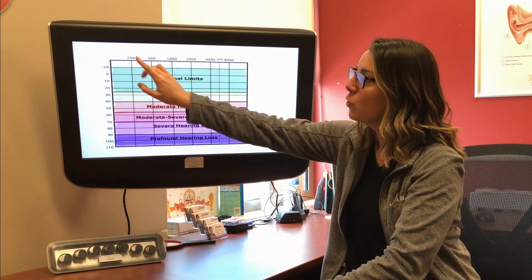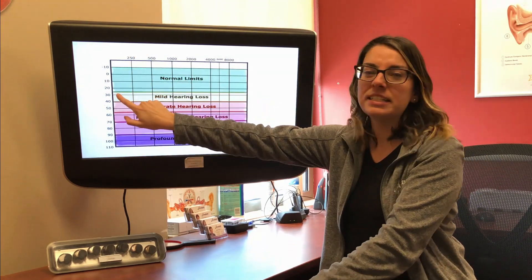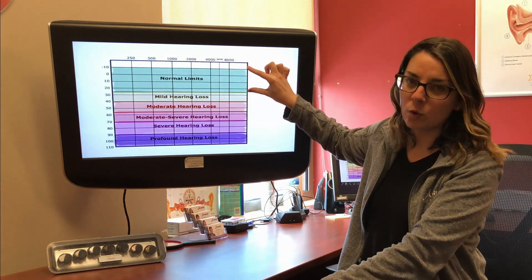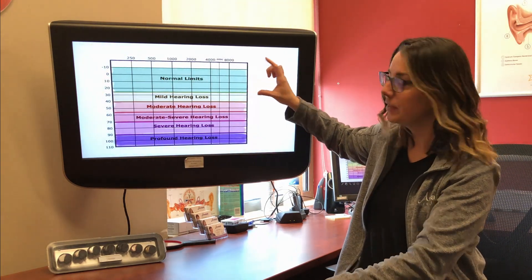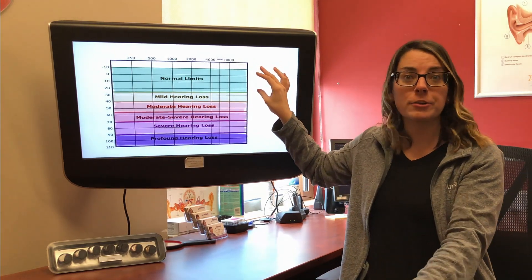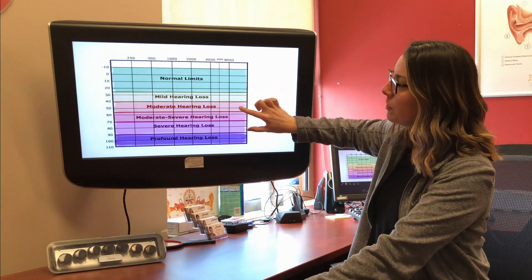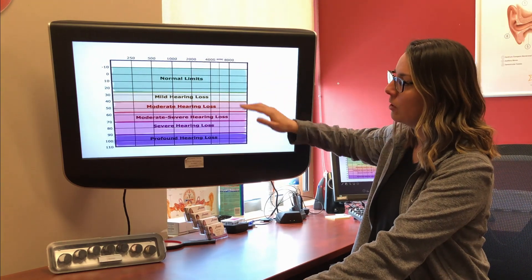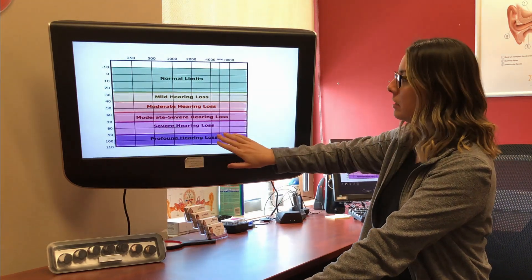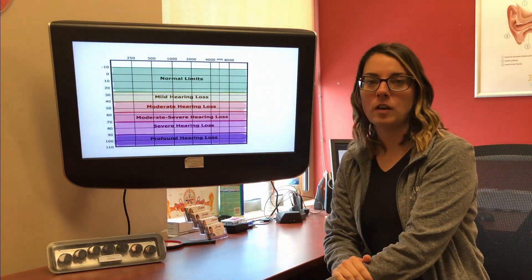We plot on here the softest level you were able to hear each one of our sounds at. Normal is anywhere from negative 10 down to about 25 — that's considered within normal limits. As you can see, that is a very large range. After that, the further down you go is considered a hearing loss, and the further down they go, the more severe the hearing loss is.